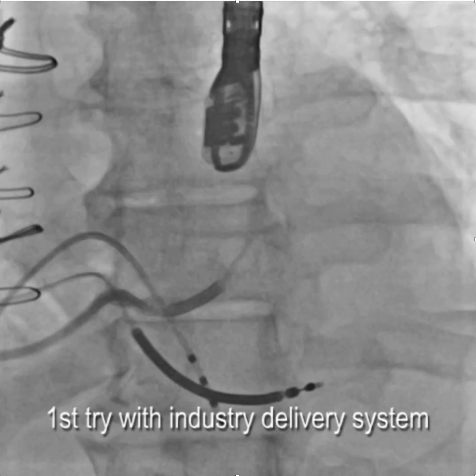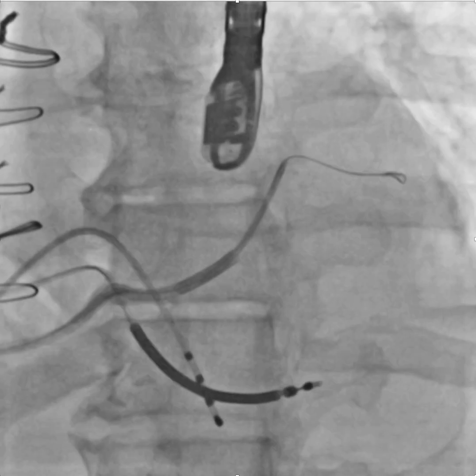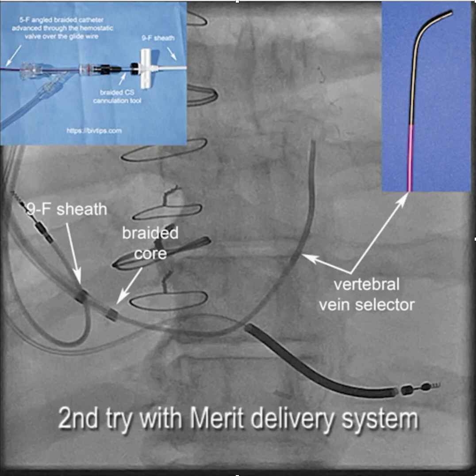On the original implant, you can see the sheath with the bend in it, the balloon — everything's trying to fall out. Almost had something there, but again, no support, and ultimately failed.